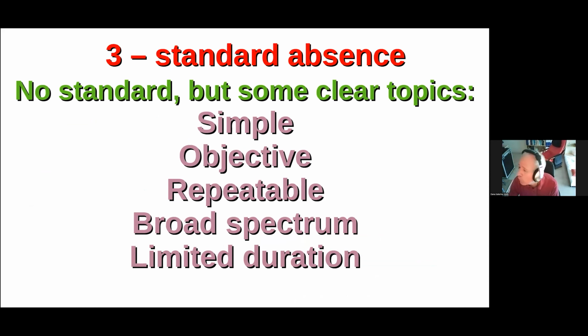The third topic is something that you know. There is unfortunately no standard in postural analysis, because every professional takes his tools, his tests and instrumentation to build his own system, focused on his own goals. But despite this, some topics are agreed by everyone.